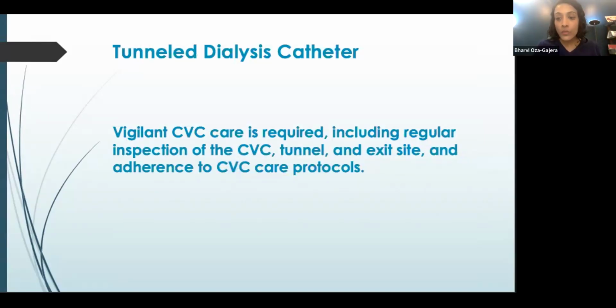Because evaluating AV accesses is different from evaluating catheters, I wanted to point out this statement from the KDOQI as well. Vigilant CVC, central venous catheter, care is required, including regular inspection of the CVC, the tunnel, the exit site, and adherence to CVC care protocols.